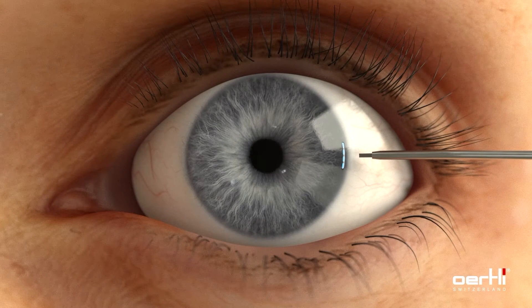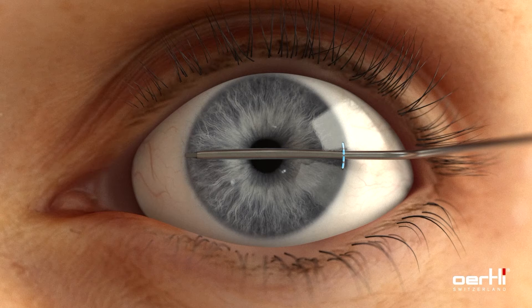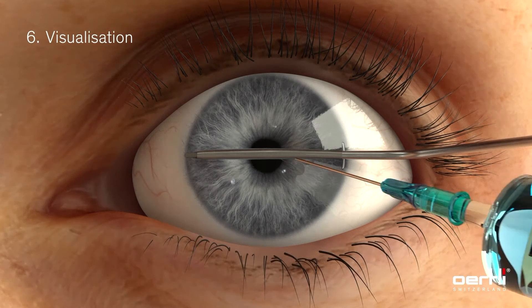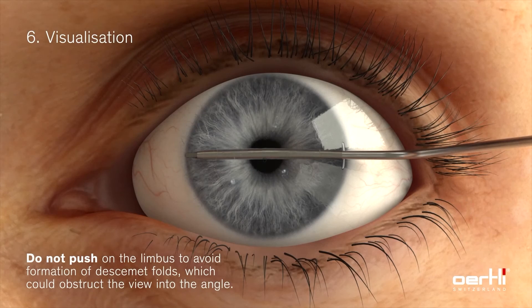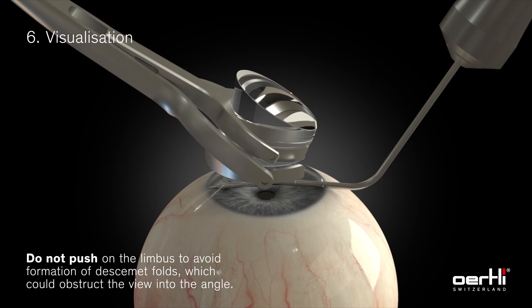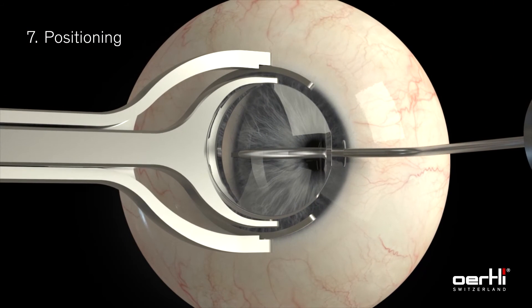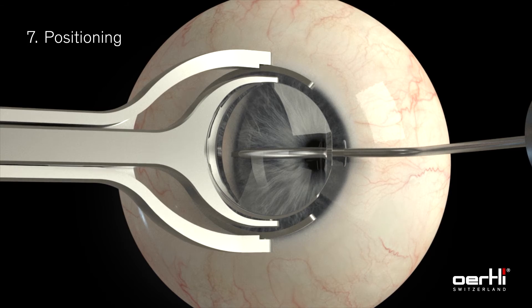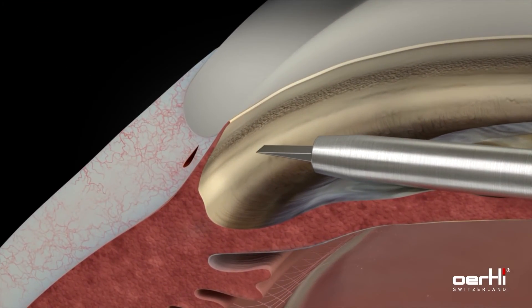The HFDS glaucoma tip is inserted through the incision and positioned at the desired point of application. For an optimal view into the iridocorneal angle, apply additional viscoelastic substance on the cornea. The gonioscopic lens is placed on the cornea, allowing visualization of the iridocorneal angle. Place the tip at the level of the pigmented trabecular meshwork.